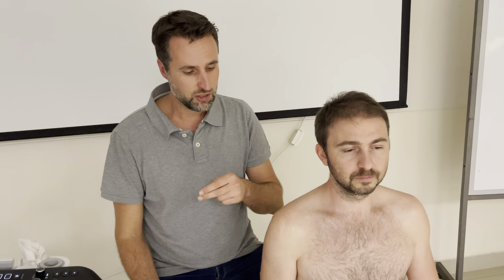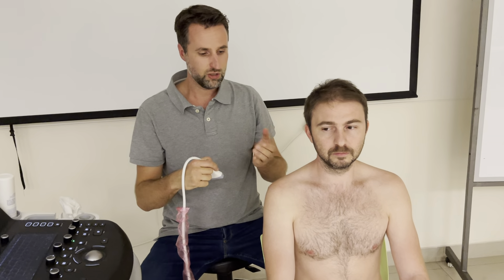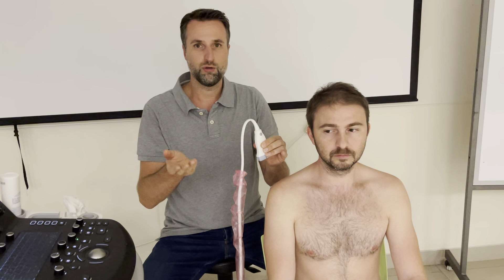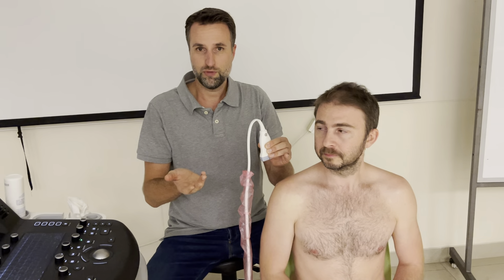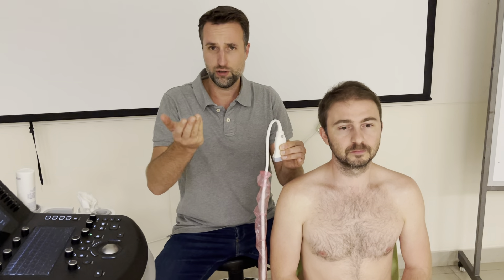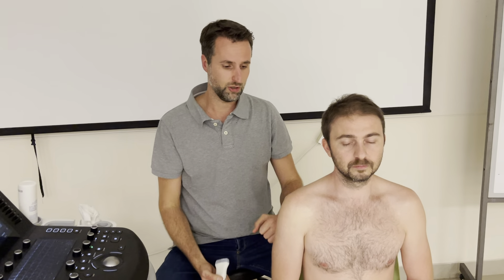It can be useful, though, for educating your patient. If the patient thinks they have a serious impingement — that bone and bone are scraping together — you can scan it, show them that it slides under perfectly, and tell them, even make it more reassuring, saying: look, it's going under very well, you have a lot of space. You create a perfect placebo. So you can also use your ultrasound scan dynamically for that, and definitely to help the patient understand it.